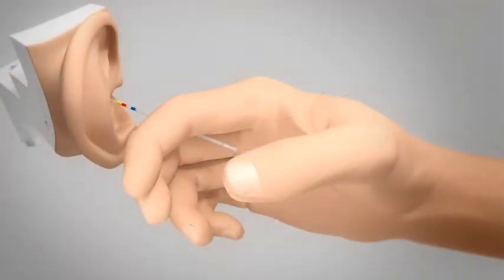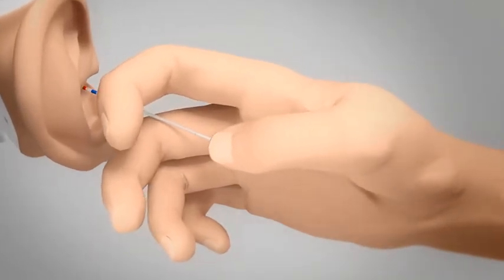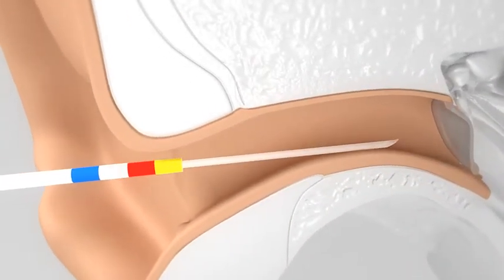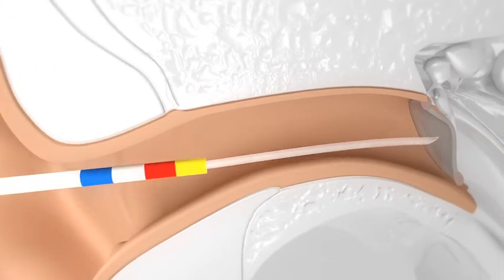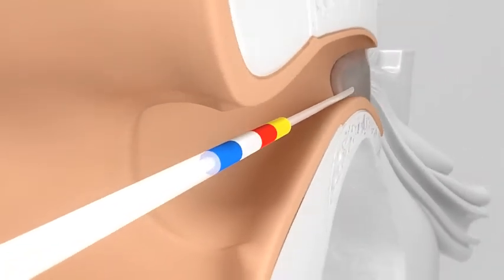Remove your index finger from the shaft. Push the back end of the sizer handle gently and slowly with your thumb while keeping the tube as horizontal as possible. The length sizer should be inserted until the soft tip touches the tympanic membrane, at which point you will feel or see the length sizer bend or bounce back against your thumb. The patient may indicate when he or she hears it or feels it.